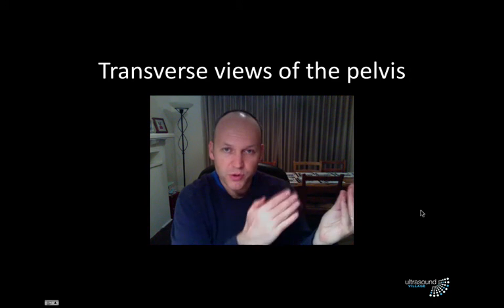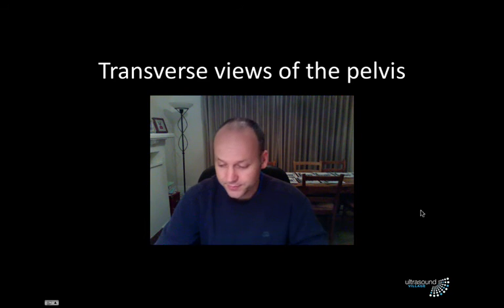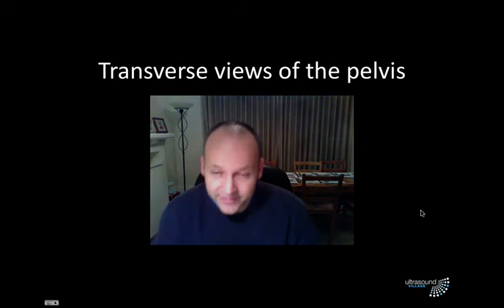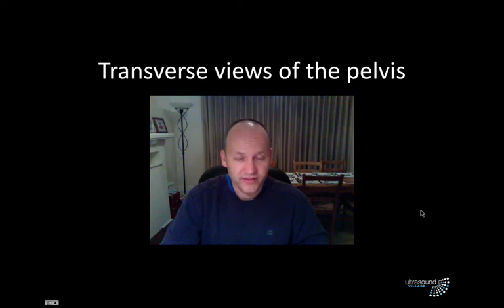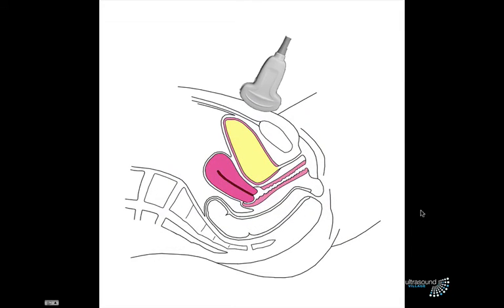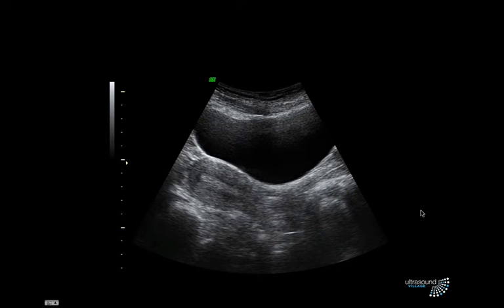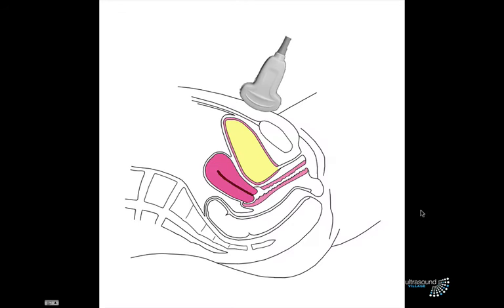And that way you've explored the pelvis from side to side and from top to bottom, and you can't miss anything, you think, although bowel gas tends to cause problems, and we do miss things. But at least you've got an orderly way of exploring the pelvis with ultrasound. So here we are doing our longitudinal image. This is what we see, and there is our picture.